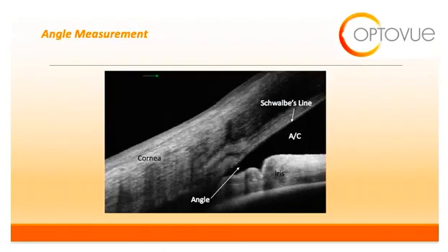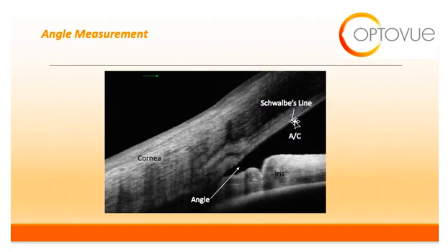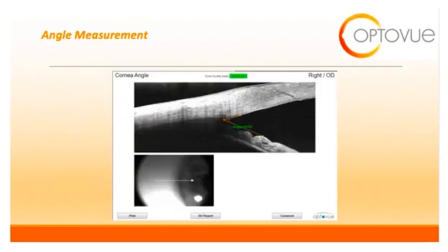Let's switch over now to the anterior chamber angle. OCT can be extremely useful in assessing the anterior chamber and can provide supplementary information on this very important structure. Here I have delineated the important points of reference — you can see the cornea, the iris, and the angle spanning between them. You can also see the anterior chamber and Schwalbe's line, the most posterior portion of the corneal anatomy. For a normal wide-open angle, we place calipers on the most posterior edge of the cornea and the most anterior part of the angle — the ciliary body band — to measure the angle.